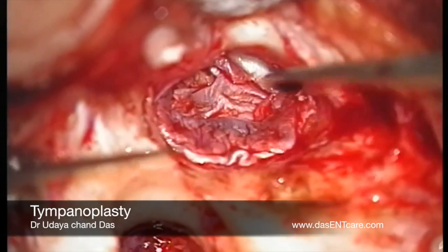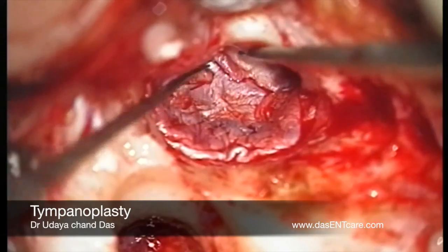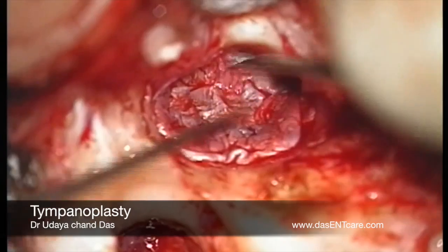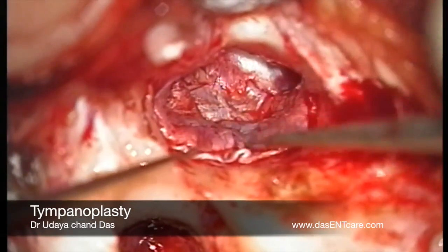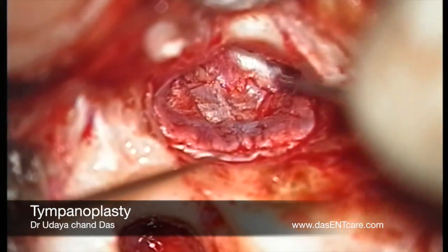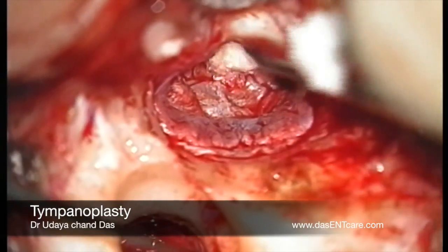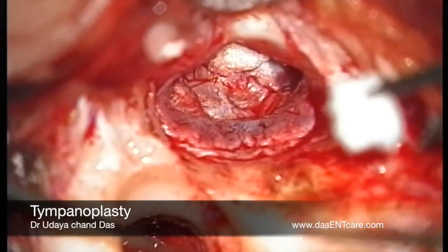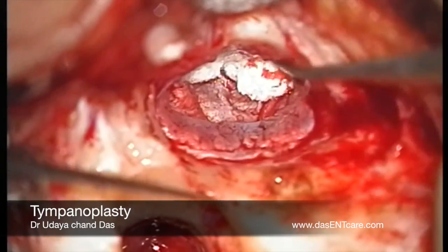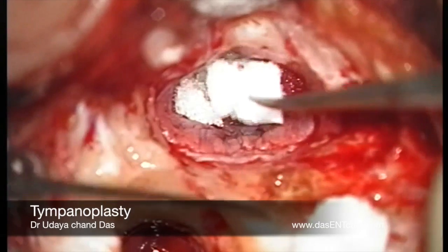Now the graft along with the tympanomeatal flap is deposited back. The graft placement is checked and the tympanomeatal flaps are meticulously deposited back to their normal position. Once that is done, the external auditory canal is filled with gel foam. This gel foam is soaked partly in antibiotic solution, and some of the gel foam is soaked in antibiotic ointment as well. The whole of the external auditory canal is filled up to the tympanomeatal flap area.